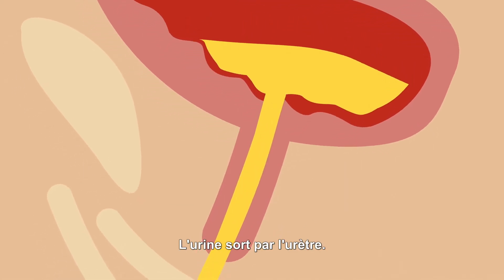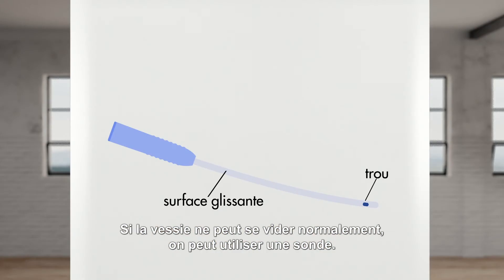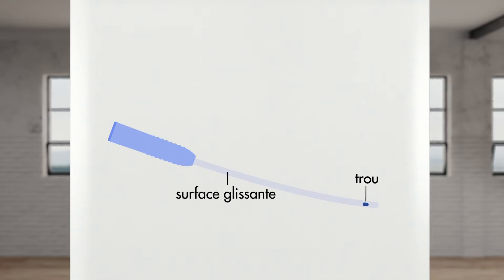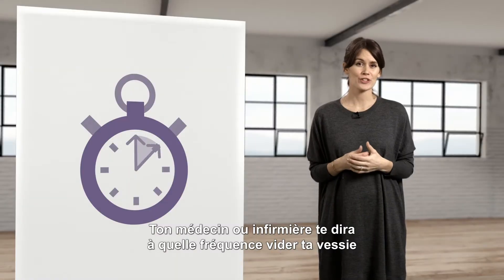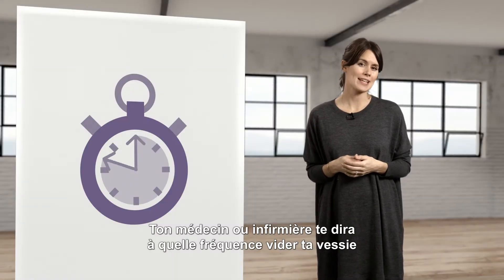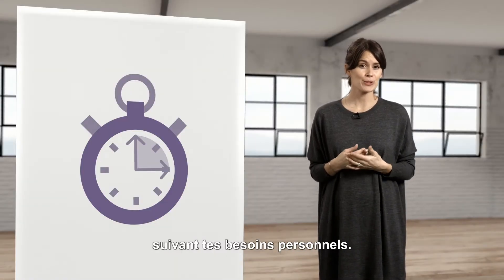The pee goes out through the urethra. If you cannot empty your bladder the regular way, you can use a catheter. It is a plastic tube with holes on one end and allows for the urine to come out. Your doctor or nurse will tell you how often you will need to empty your bladder based on your personal needs.